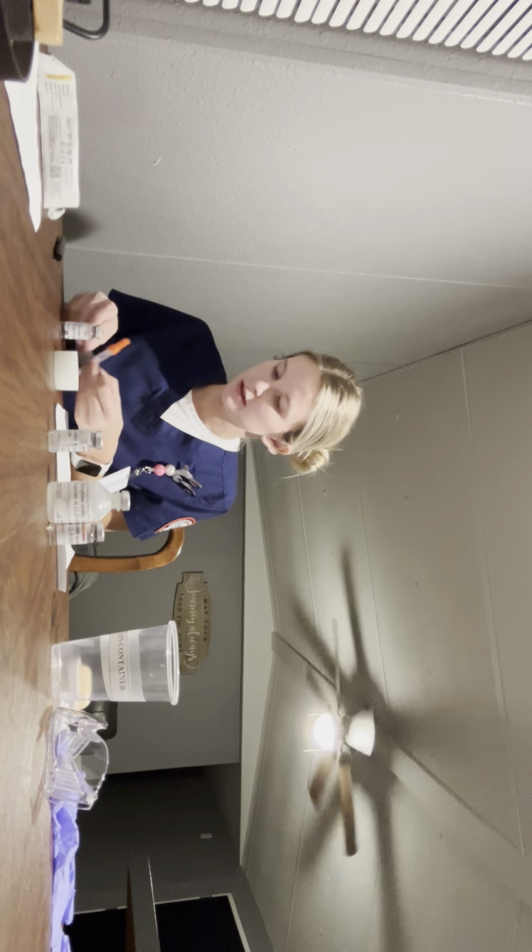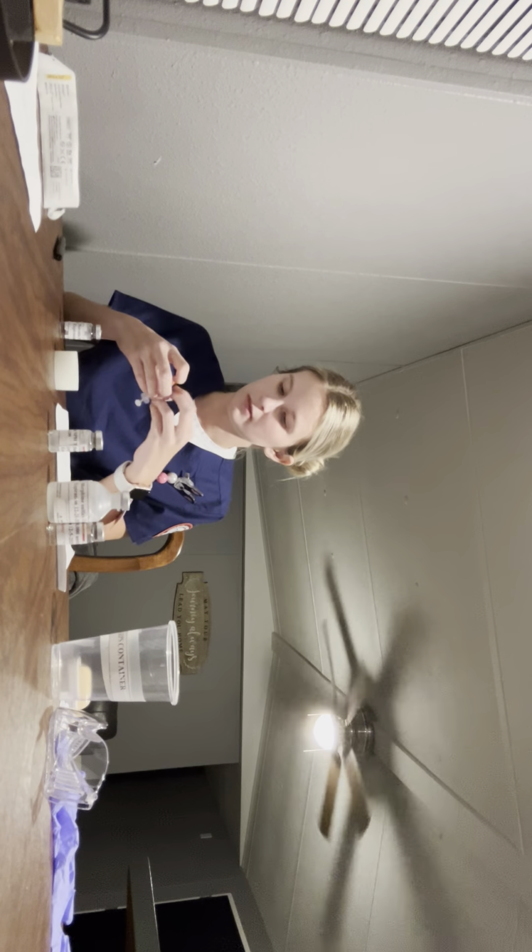So then I'm going to place it on my syringe, so that I know. So that's right documentation. So now, before I go into my patient's room, I want to make sure I have my MAR. I have my vial, my syringe, my gloves, and my goggles. So then I'm going to do hand hygiene.